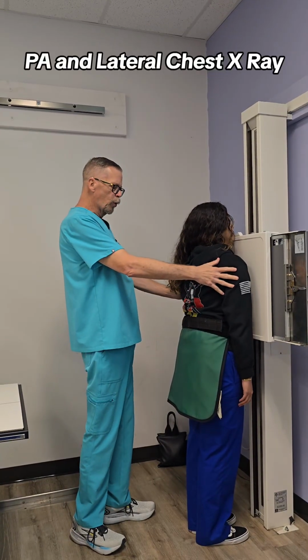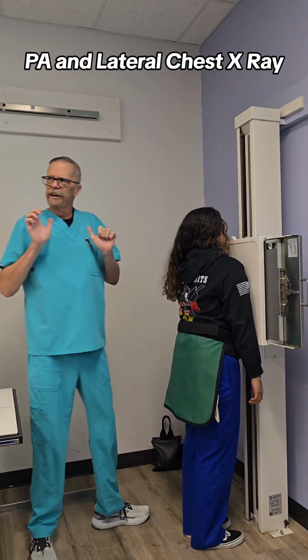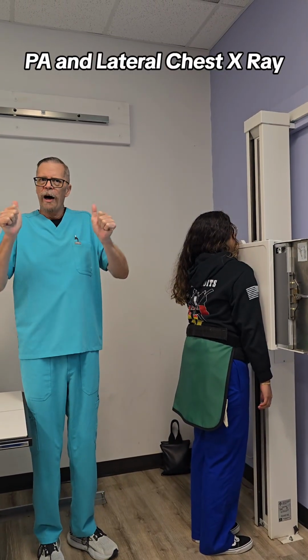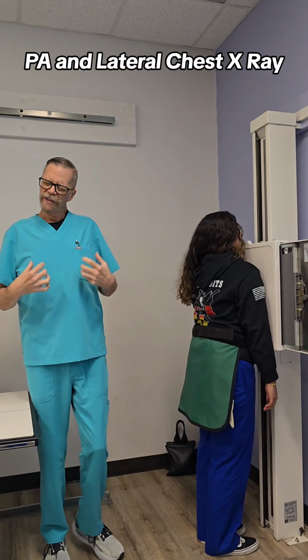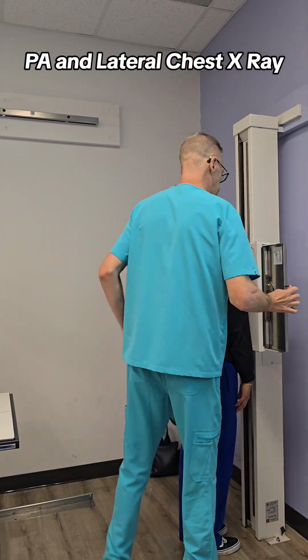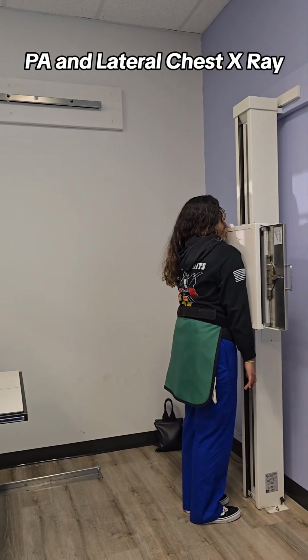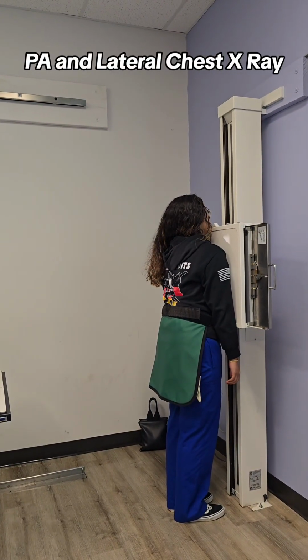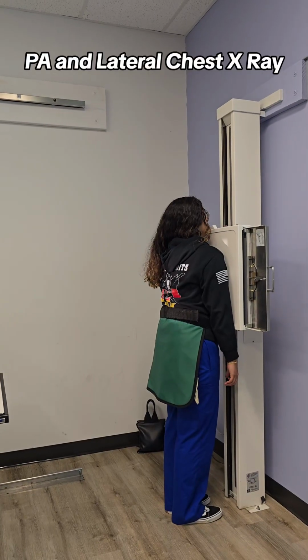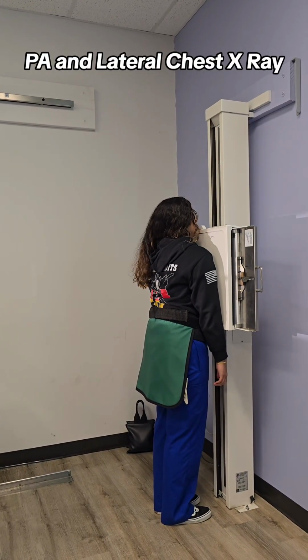We're going to have the patient roll their shoulders forward. Bring your hands up to the side a little bit. There we go. We want to get the scapulae pulled out laterally a little bit so they don't interfere with the lung field as much. Obviously, as always, we line up our CR and our IR, which is really hard to see with all the lights on. There we go.